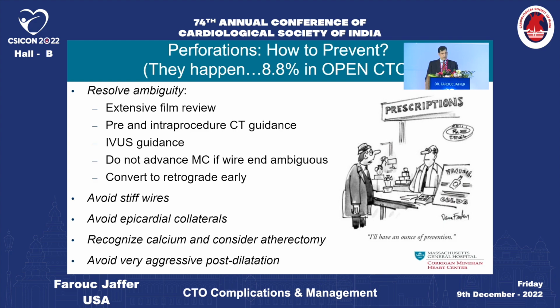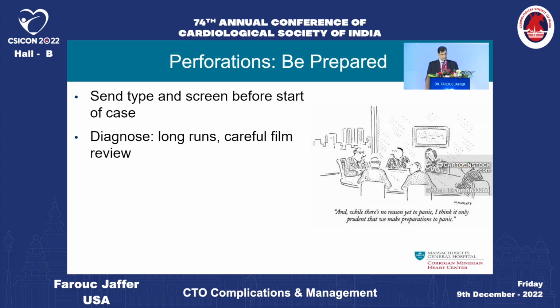And avoiding very aggressive post-dilatation. I think we've definitely seen that, and I'll show you a case of that next, where sometimes, especially using imaging, if one is not careful with the initial measurements, thinking about if one sizes EEL to EEL, and one has a subintimal part of that, sometimes one can be overly aggressive and lead to perforations from the post-dilatation.